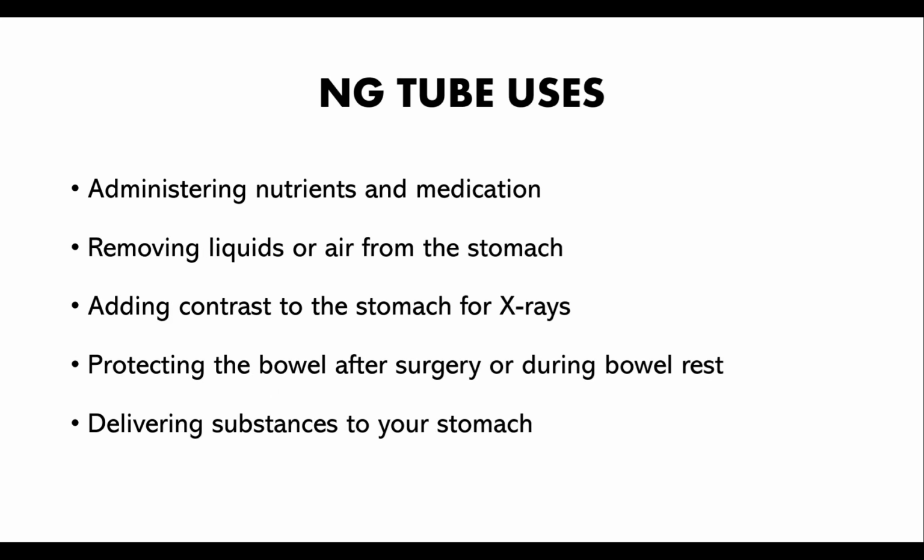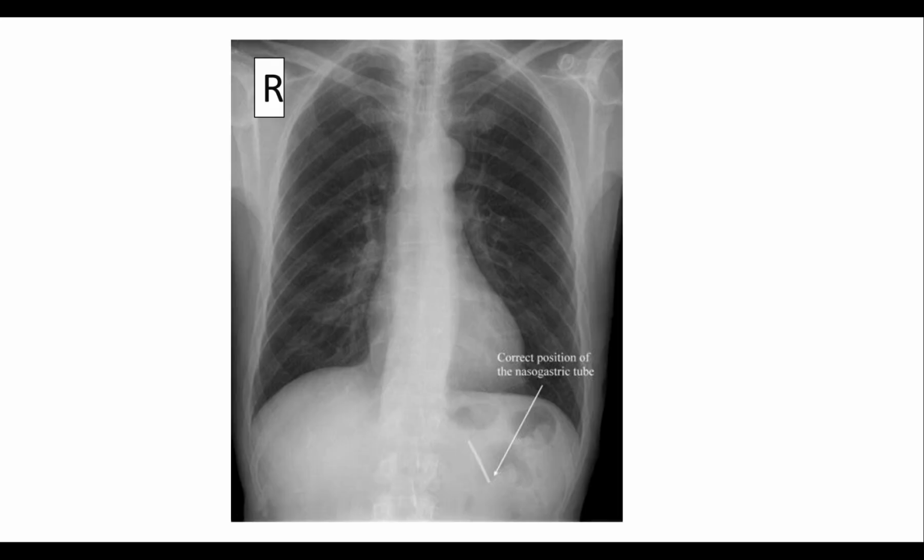NG tube uses: administering nutrients and medication, removing liquids or air from the stomach, adding contrast to the stomach for X-rays, protecting the bowel after surgery or during bowel rest, delivering substances to your stomach. Correct position of an NG tube.